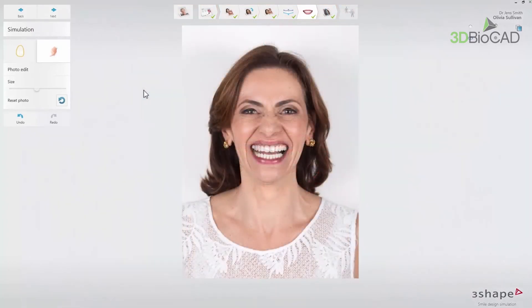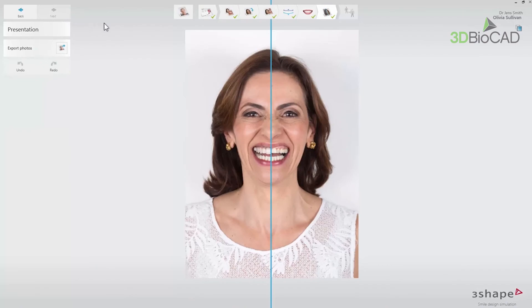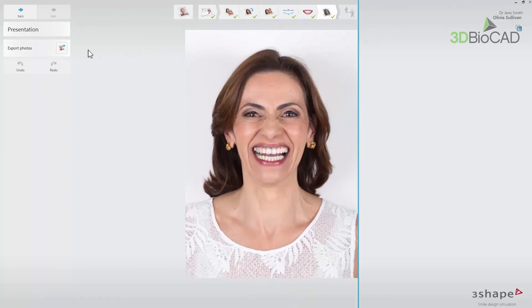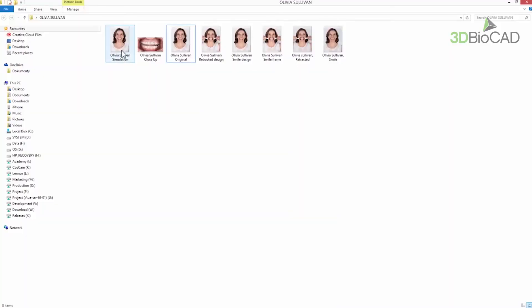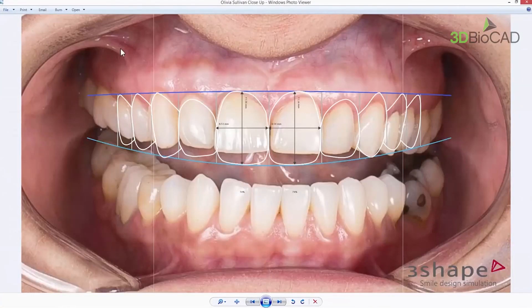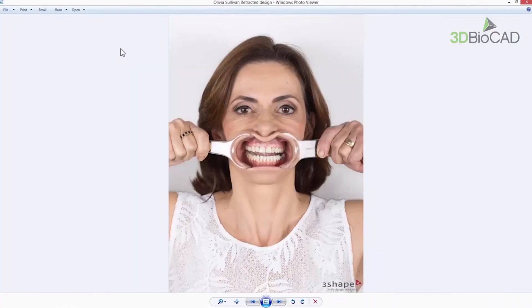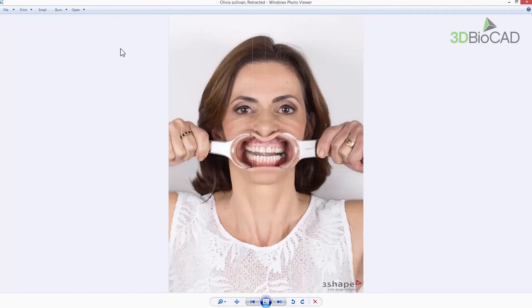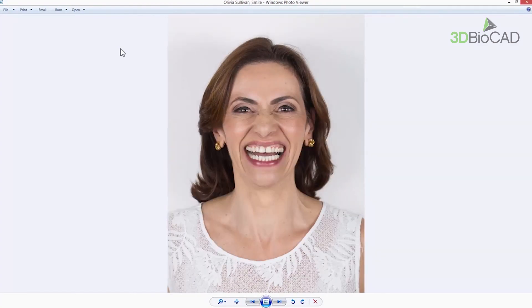When the smile design is ready, click Next to find yourself in the presentation step, where the slider allows you to compare the design outcome with the current dentition. At that step, you can use the Export Photos button that allows you to choose the location and export the photos in PNG format. Now you are familiar with the tools available in the Smile Design application.